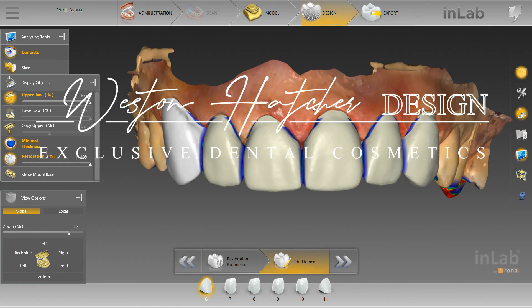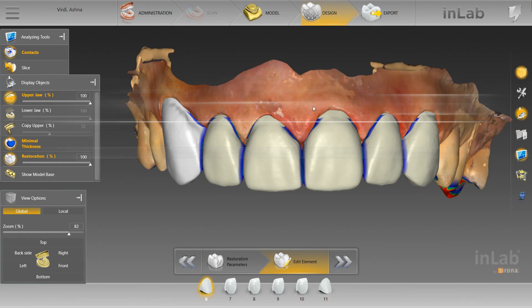Hey guys, so today what we're working on here is a six-unit anterior case. This was sent to me via Serona Connect from a CEREC dentist. I'm simply going to design this case and send the design file back to the dentist for the dentist to mill the crowns and seat the restorations.